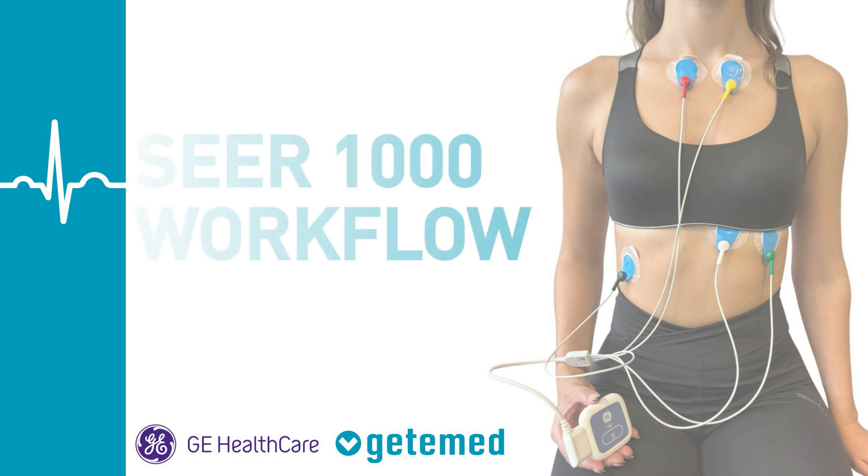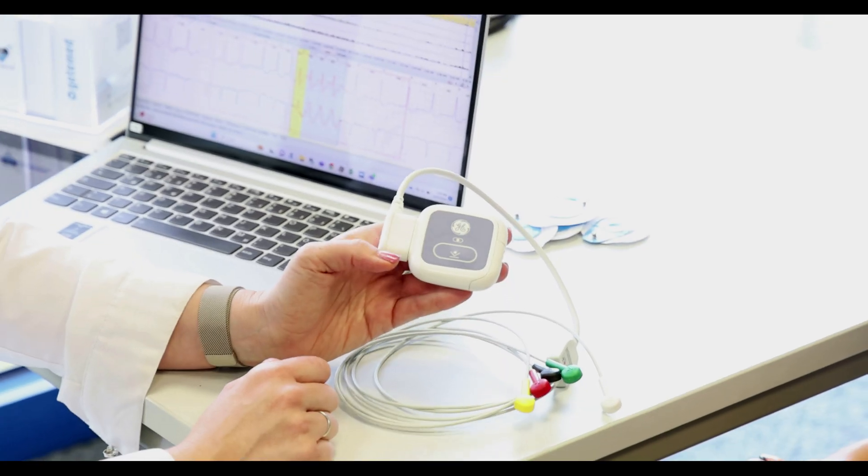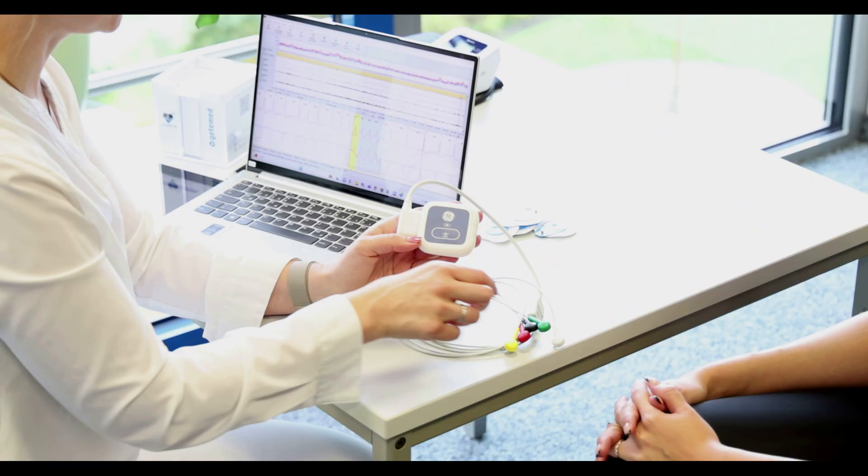Hello and welcome to the SEER 1000 workflow. The SEER 1000 is a long-term ECG recorder that allows you to record an ECG of up to 7 days.